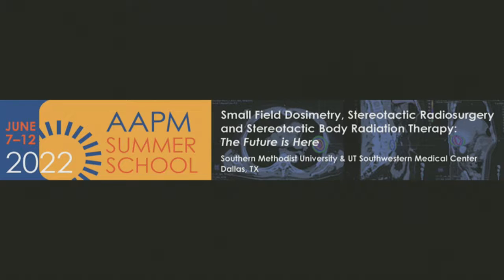Yeah, so we have a big effort internally at MSK on dose accumulation, which is based on deformable image registration. To be honest, we are very, very particular about knowing that it's not accurate, and we are very careful about that. So we don't have a wide implementation of dose accumulation yet. We are doing a lot of work on trying to understand the uncertainties from deformable image registration that will bring uncertainties to dose accumulation.